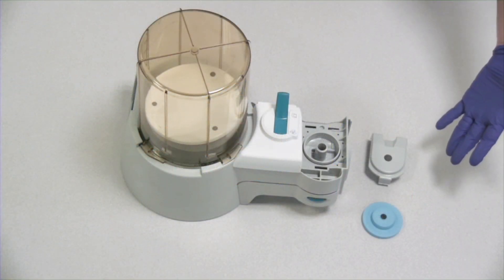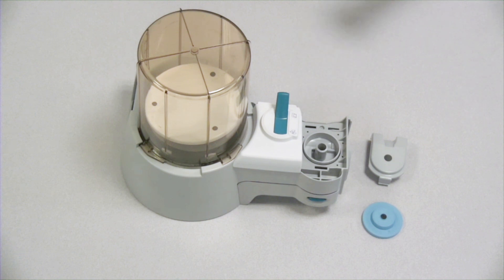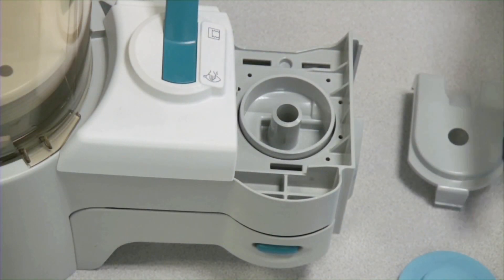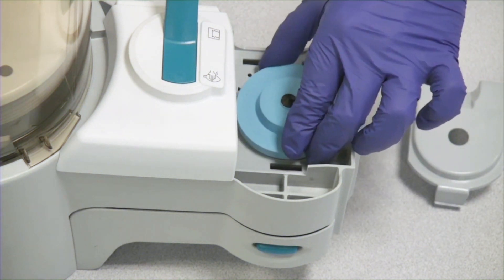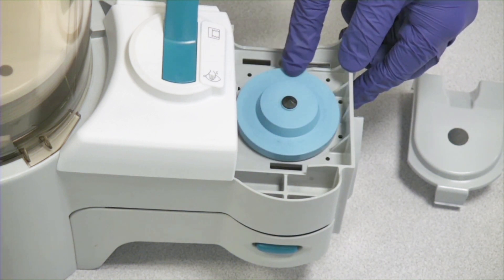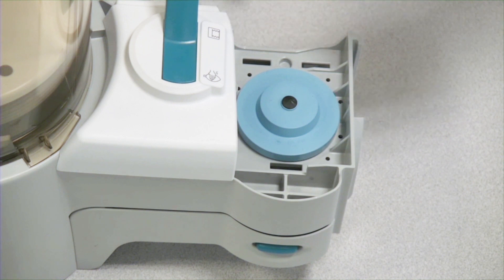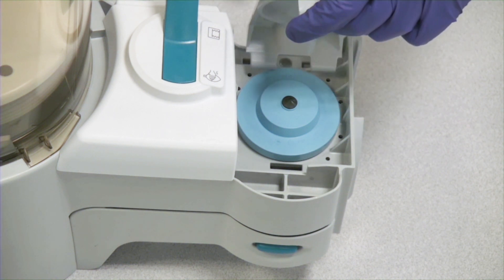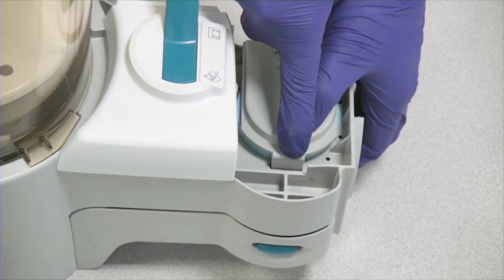To assemble the breathing system, I'm first going to use the bellows base assembly, the APL valve ramp, and the APL valve diaphragm. I'm going to first insert my APL valve diaphragm, put it in place, and push it down to make sure it's seated. Next, I'm going to take the APL valve ramp, insert the ramp tabs into the slots, rotate the ramp, and press it down so it locks.